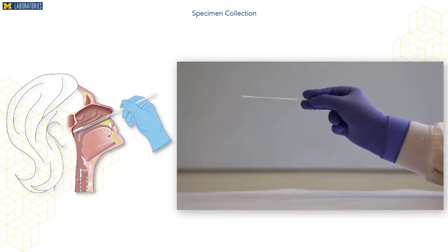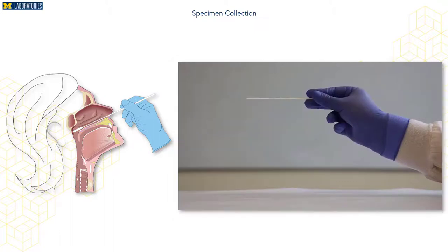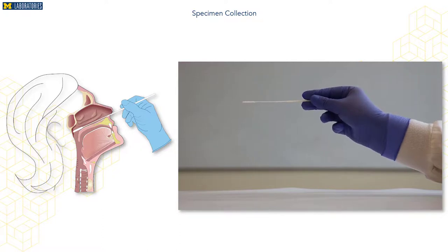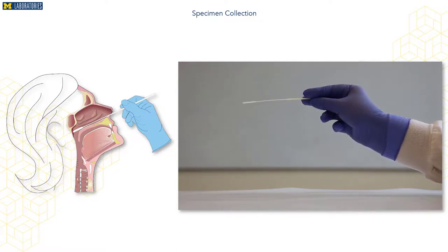Instead, the swab should travel along the floor of the nasal pathway, reaching the break point of the swab to the nostril. Once resistance is felt at the nasopharynx, rotate the swab several times on the nasopharyngeal membrane to allow adequate collection of epithelial cells.